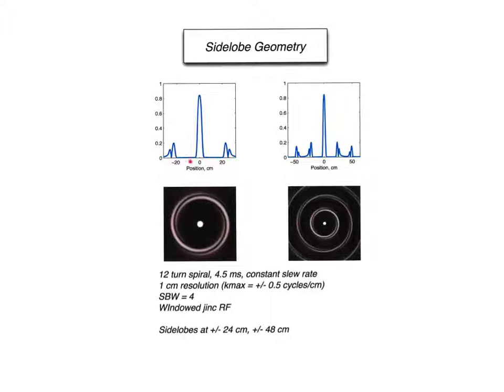So here's a zoomed in view where we see the first side lobes, and then if we zoom out by a factor of 2 further, we see the second side lobe structure appear. Right? So we get this repeating side lobe structure. You can see that it goes out to 3 side lobes here as we keep moving out.